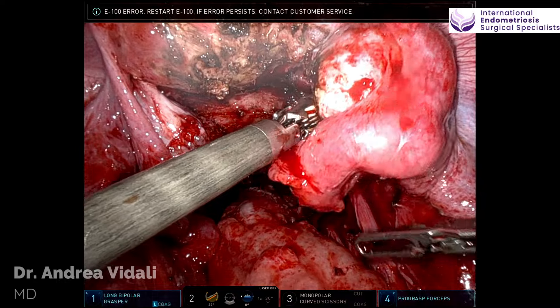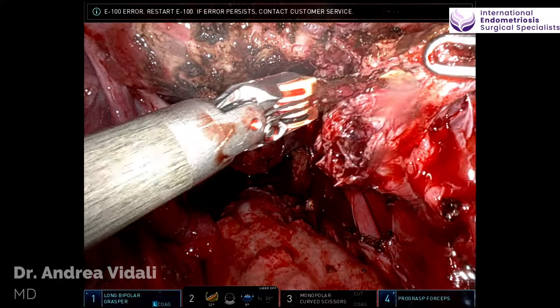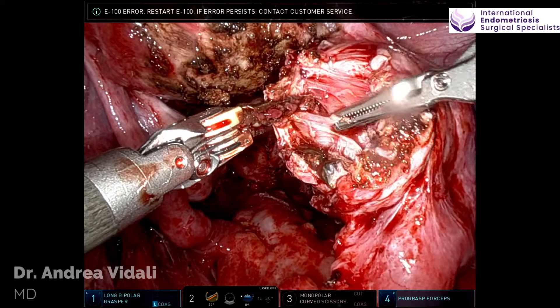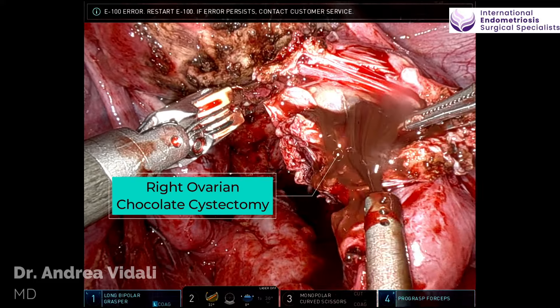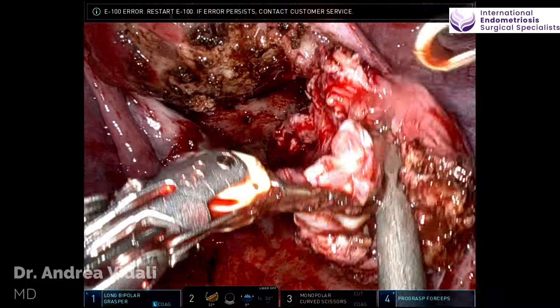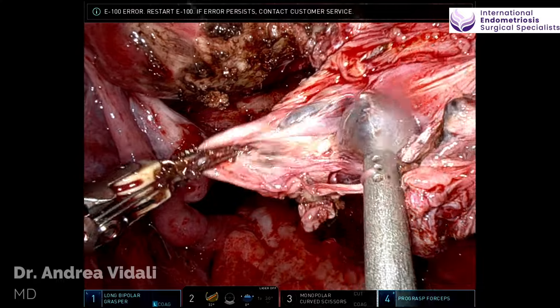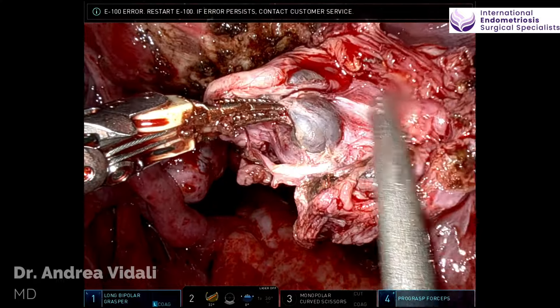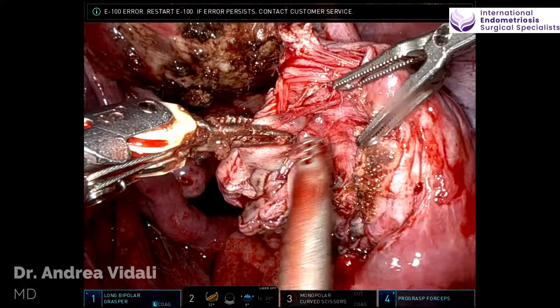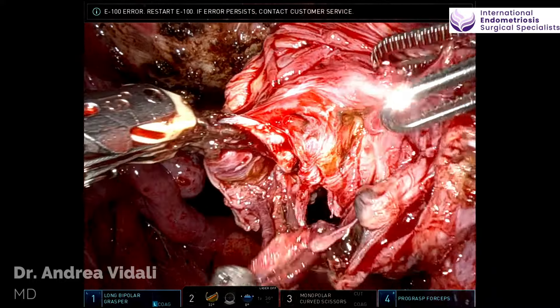The left ovary contained a small type 2 endometrioma, and here on the right side you could see another type 2 endometrioma. How do we understand that it's a type 2? Ultrasonographically, some of the classic signs are the multiloculation, the fact that it's a lot more tenacious to the ovary, and that it involves a lot more cortical tissue. All these components together are part of the characteristics of a type 2 endometrioma.